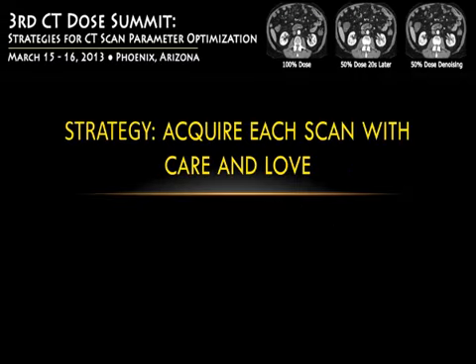So when appropriate, and if you have access to one, use an evidence-based, practice guidelines-based system, and that'll help a lot in terms of reducing the dose. The second strategy is to acquire each scan with care and love. Okay, sounds Zen-like. Care and love.